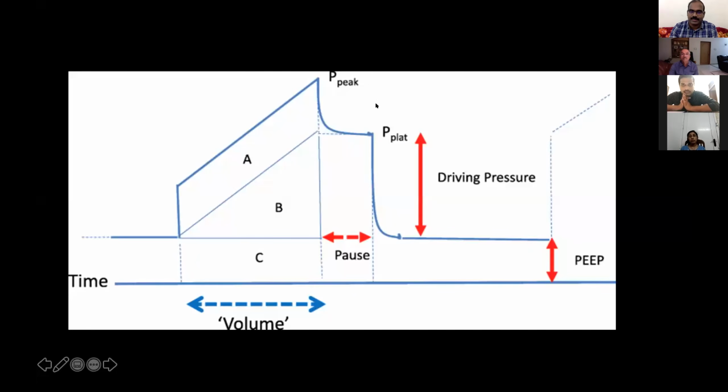When you give an inspiratory pause of around 1 to 2 seconds, you get a plateau pressure, an equilibrated pressure. The difference from the baseline pressure, PEEP, is the driving pressure. The plateau pressure is the pressure actually reflected at the level of the alveoli. When speaking about barotrauma, plateau pressure was the indicator discussed previously. Nowadays we are switching from plateau pressure to driving pressure.